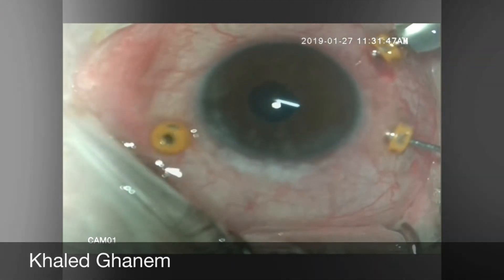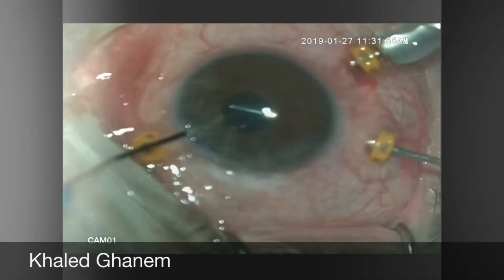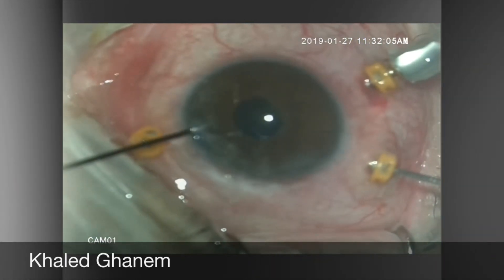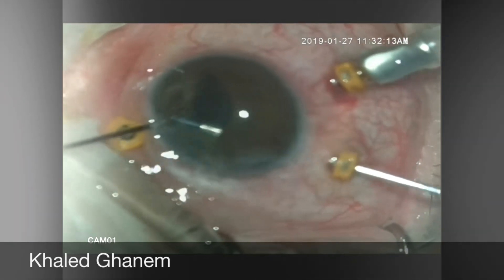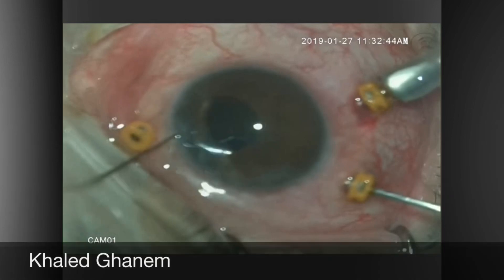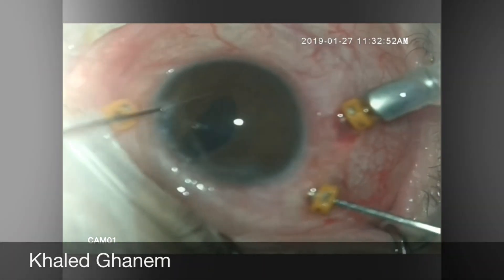This technique is very helpful if you have good capsular support and are planning to implant the same IOL in the sulcus. It is much easier to push the iris under the IOL rather than trying to push the IOL from below to above.